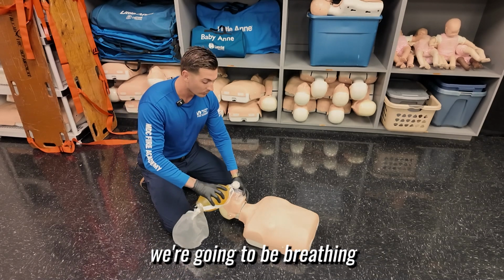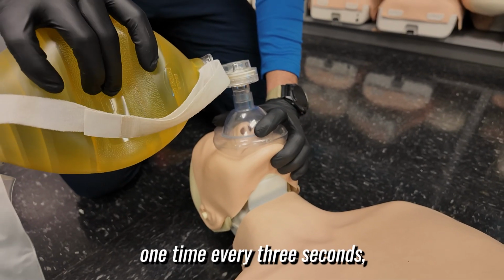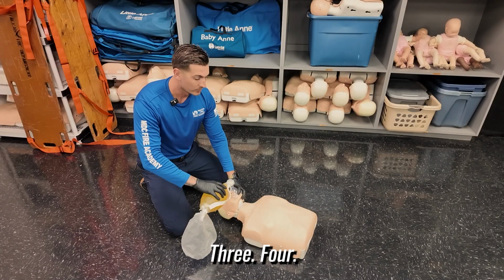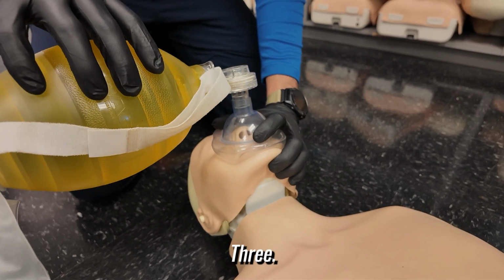After that, for an adult, we're going to be breathing 1 time every 5 seconds. And if it's a pediatric, 1 time every 3 seconds. We're only squeezing the bag until you have chest rise. 2, 3, 4. 2, 3, 4.